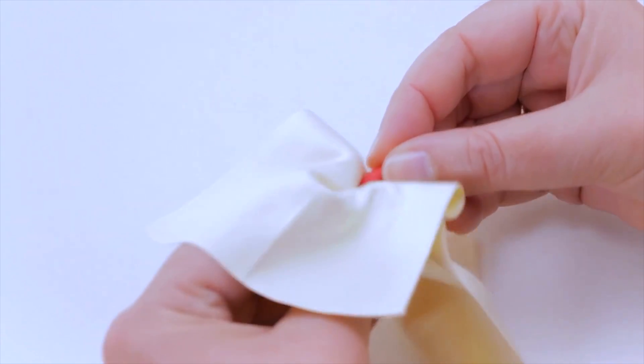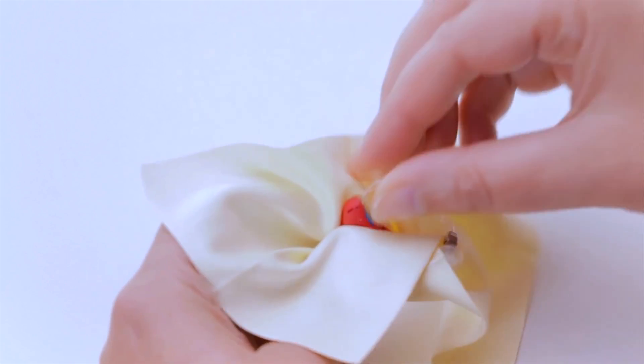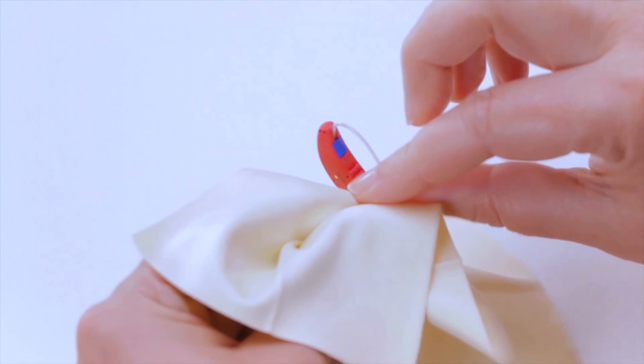Regardless of what type of hearing aid you have, on a daily basis, wipe the outer casing with a dry microfiber cloth. More stubborn dirty spots can be wiped away with a damp cloth.